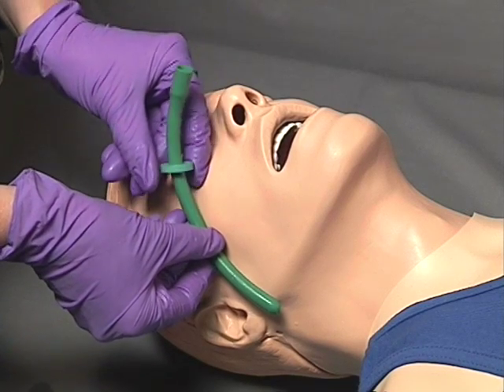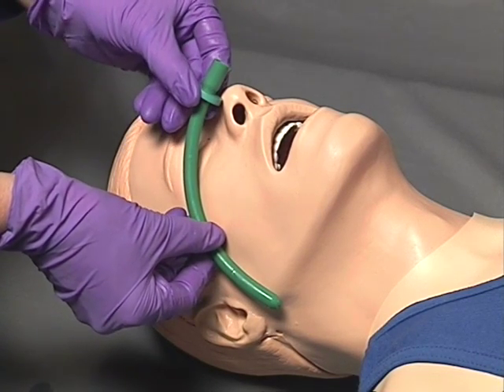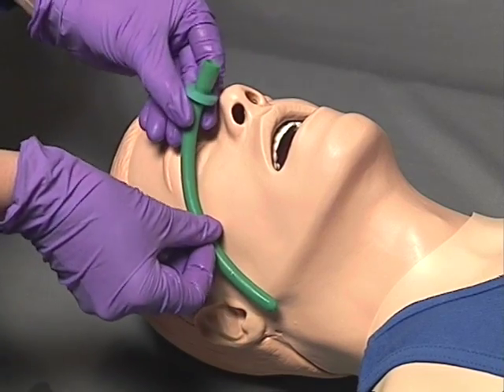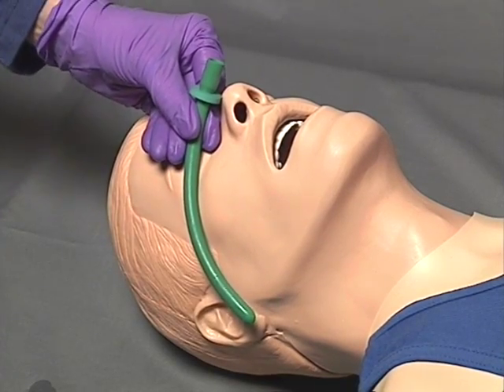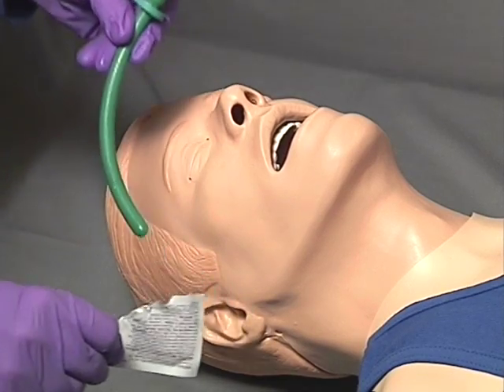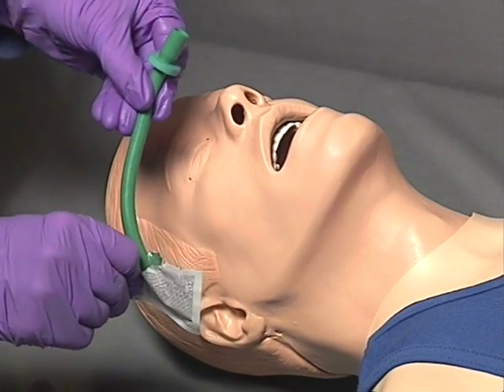The rubber washer or grommet can be slid back and forth on the device to ensure a proper fit. Lubricate the distal surface of the airway with water or a water-soluble lubricant.